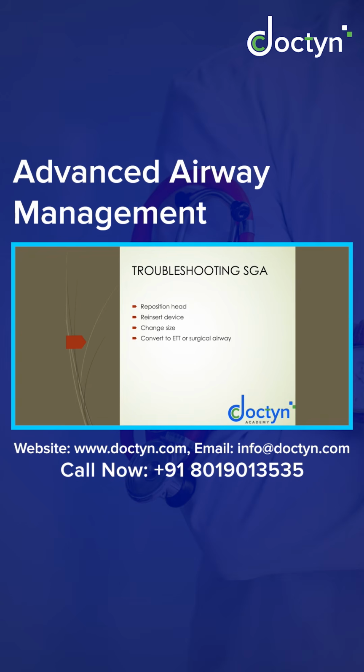Else, if all these three also fail, then you convert it to an endotracheal intubation, like a definitive airway or a surgical airway.